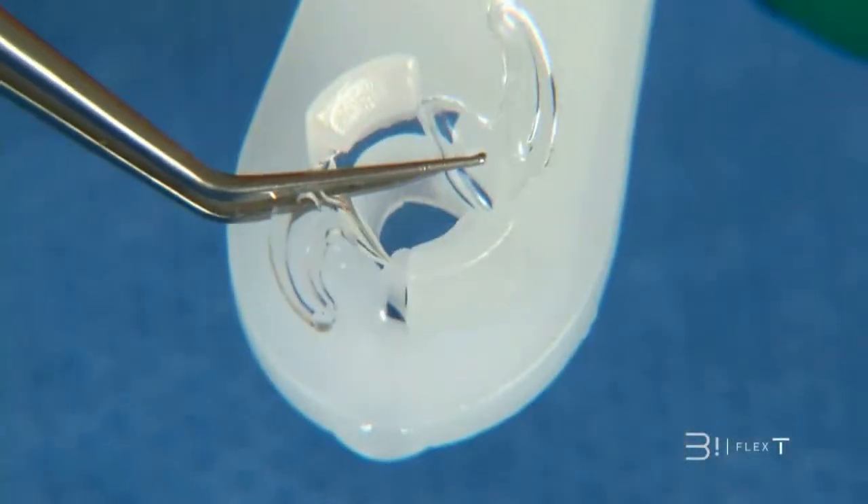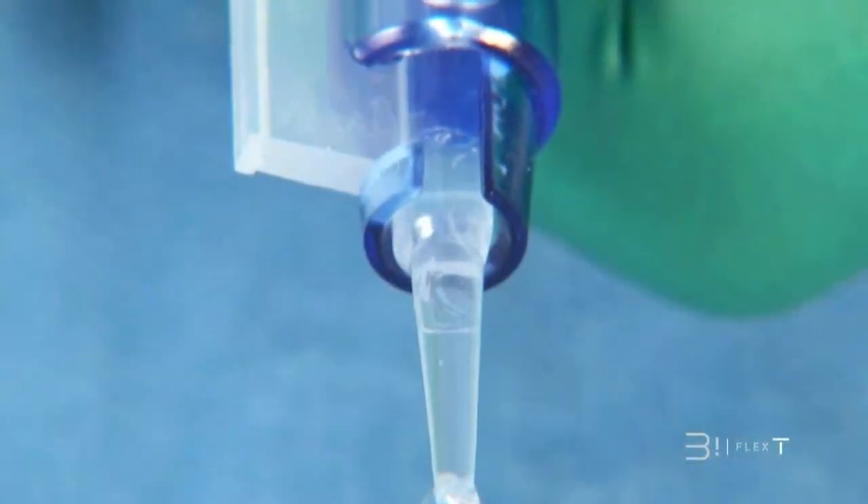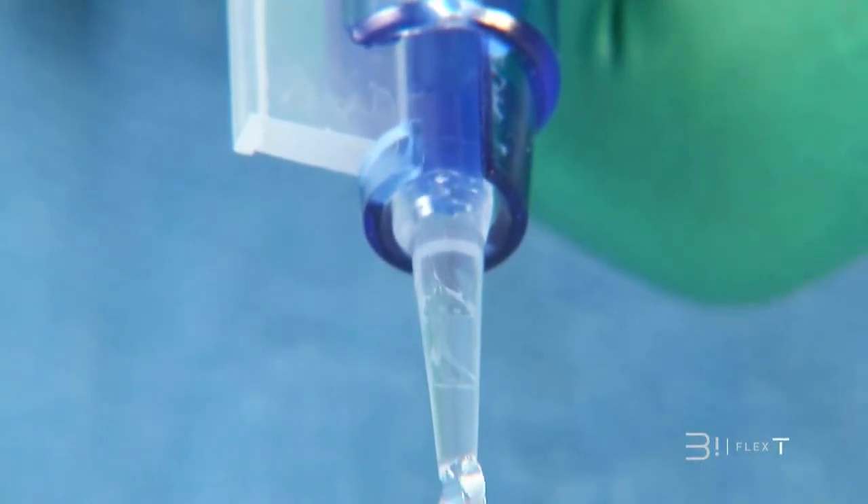Complications may arise during implantation. I'm thinking of a scratch on the surface of the lens if the implant has been mishandled, or a haptic getting stuck in the injector if it was mispositioned within the cartridge. In cases such as these, you shouldn't hesitate to enlarge the incision and withdraw the lens.